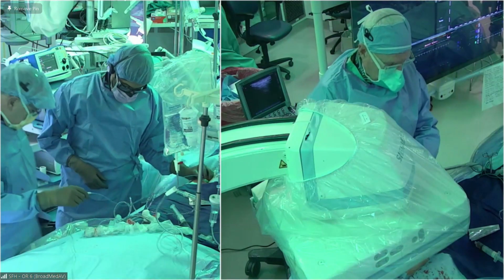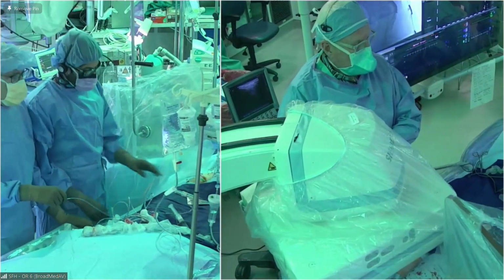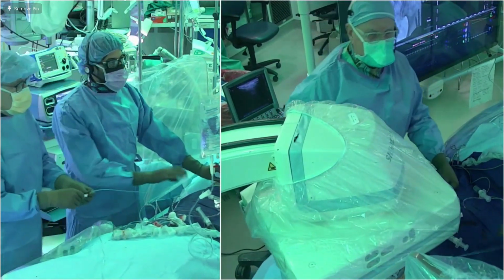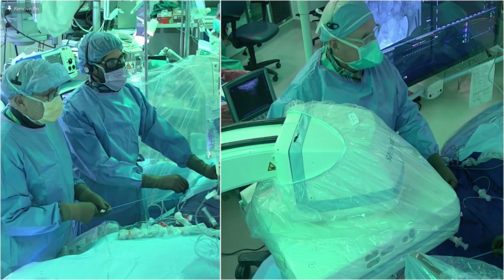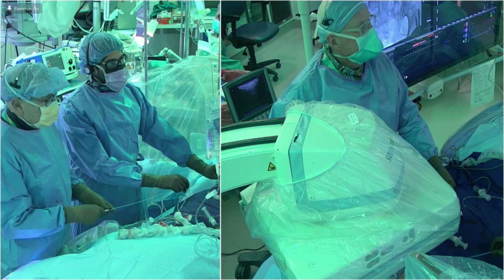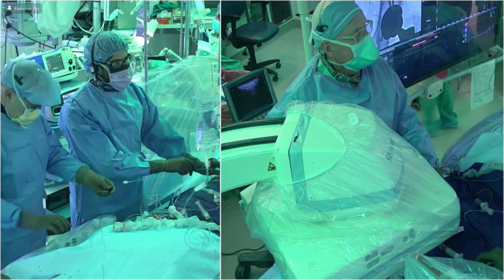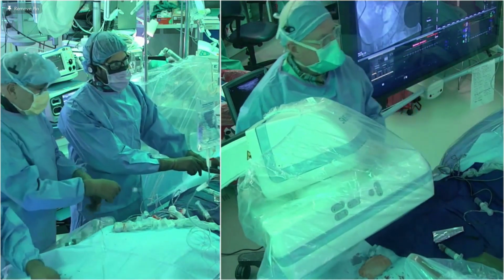Well, thanks everybody for rejoining us. Dr. Khan and Dr. Petrosian and myself enjoyed our Concorde flight back to the USA, back to the hostile environment. So here we are back at Roslyn, and we're doing a transfemoral aortic valve replacement.